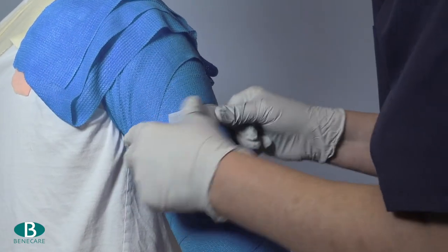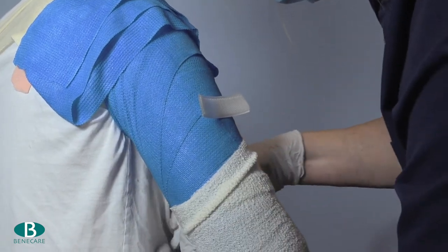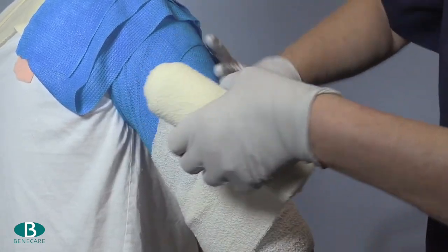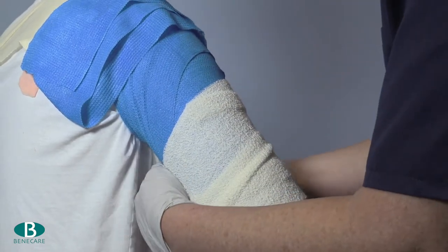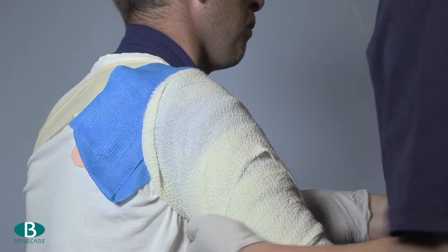Now place two or three pieces of adhesive hook to the brace dependent on the length of the limb, and secure with a wet bandage following the same process as with the casting material across the shoulder.